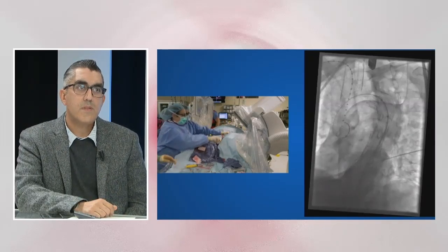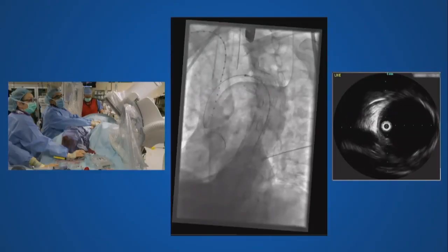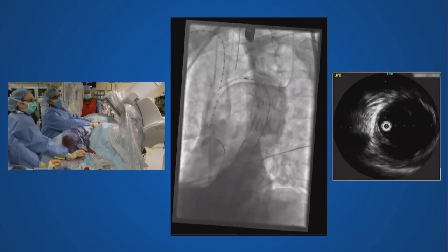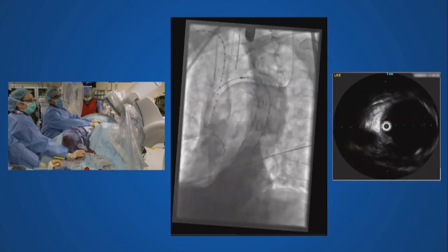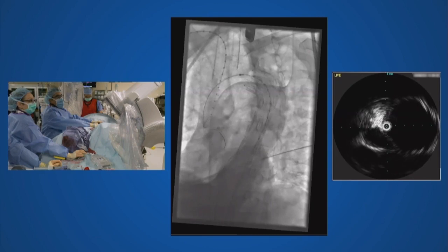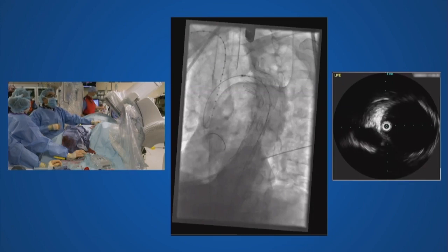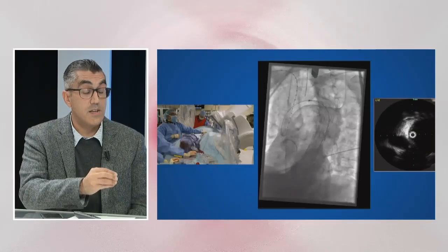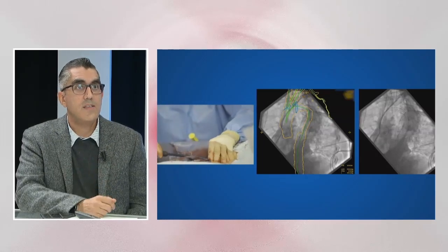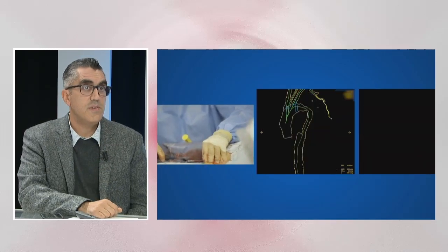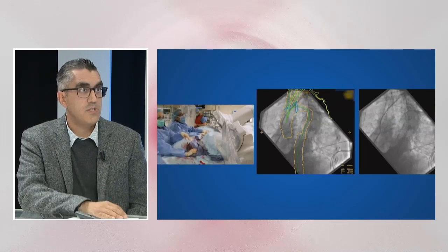You can see us doing the ballooning with my partner Dr. Doucette. Our stent was initially in perfect position, but we were concerned about the coarctation happening at the distal arch, which was related to the patient's own narrowed true lumen. Even though we ballooned and the device shifted slightly, we didn't lose our registration — our subclavian is still marked and we had memory on the table meaning we had marked the patient's position.